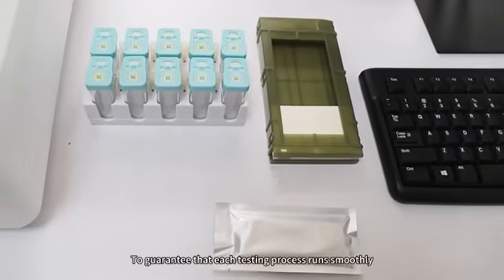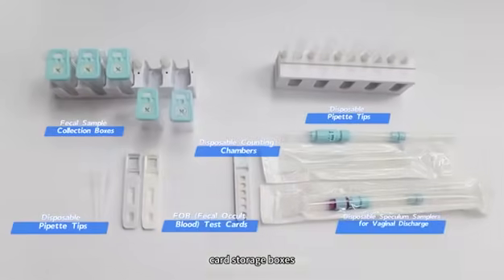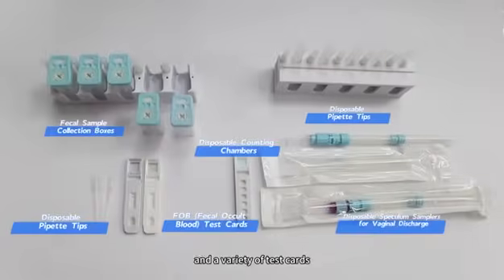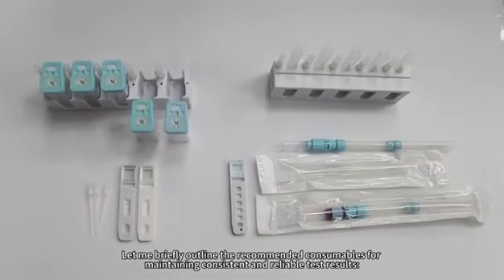To guarantee that each testing process runs smoothly, we offer a range of specially designed processes. These include dedicated specimen racks, card storage boxes, and a variety of test cards. Let me briefly outline the recommended consumables for maintaining consistent and reliable test results.